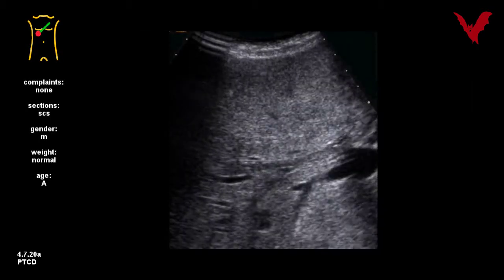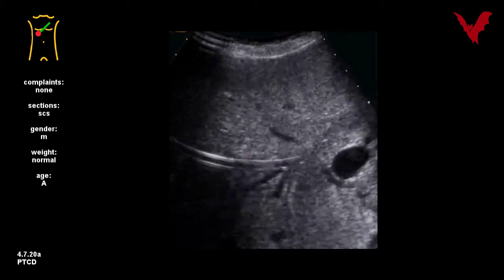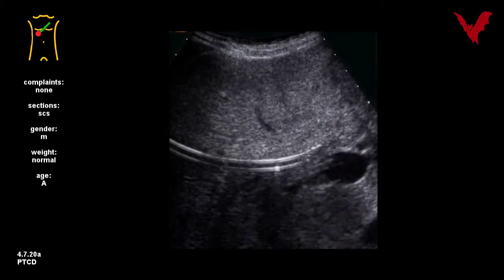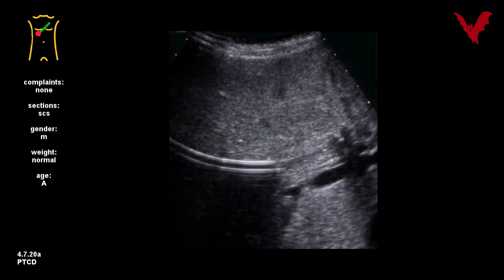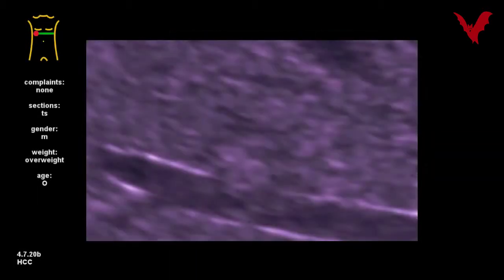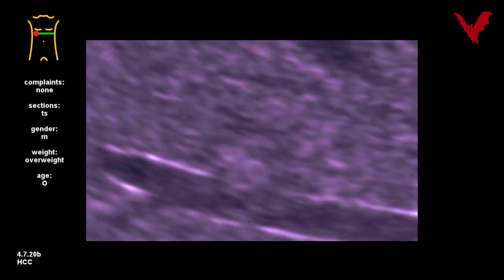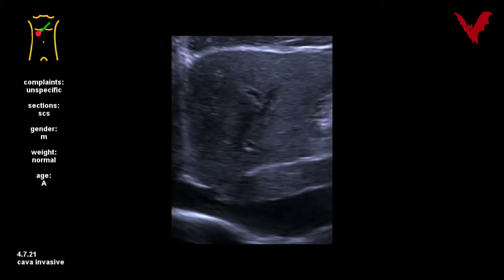A well-draining PTCD is shown in 4.7.20a. A really small HCC is depicted in 4.7.20b, visible mainly due to its invasive growth and the high-impedance structures of the surrounding hepatic vein blood. Another HCC in 4.7.21 is mainly unmasked by its deconfiguration of the caudate lobe, segment 1.